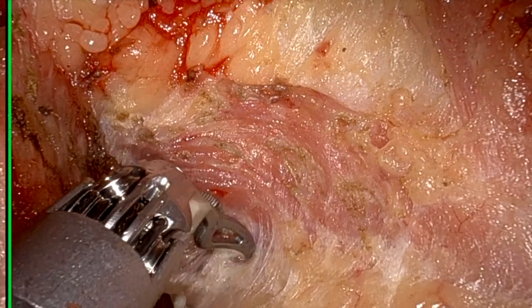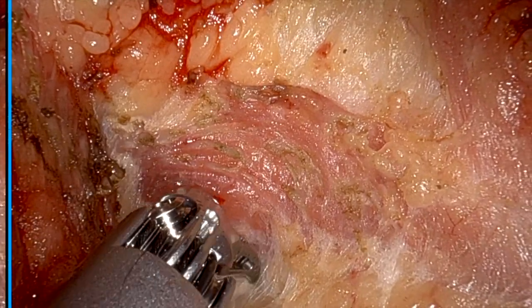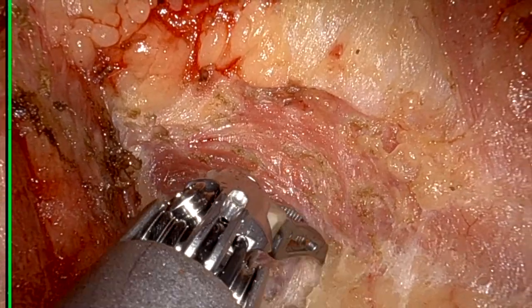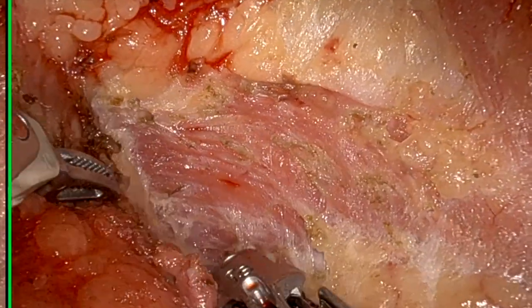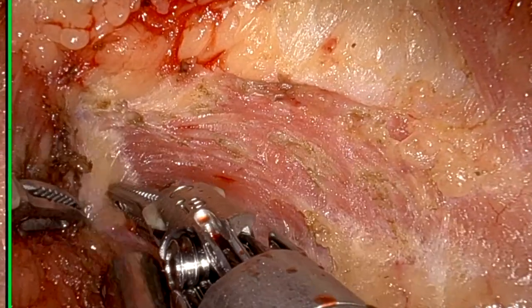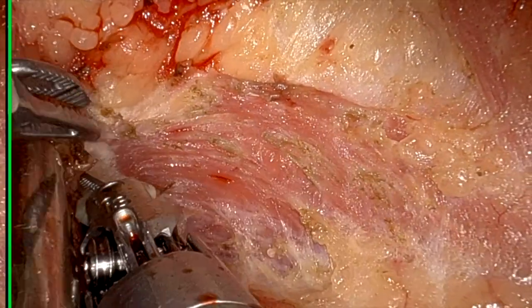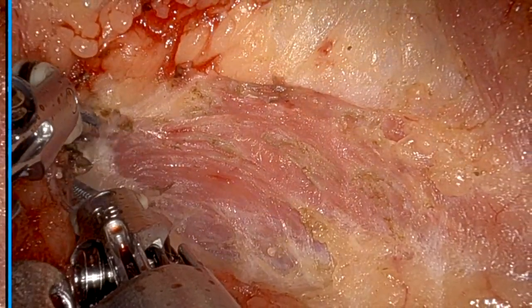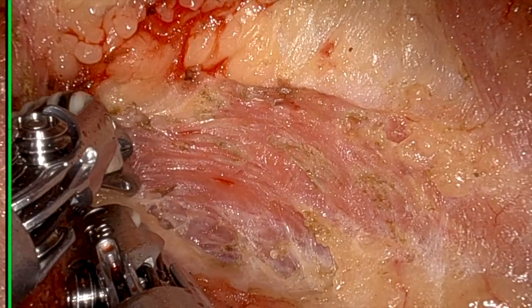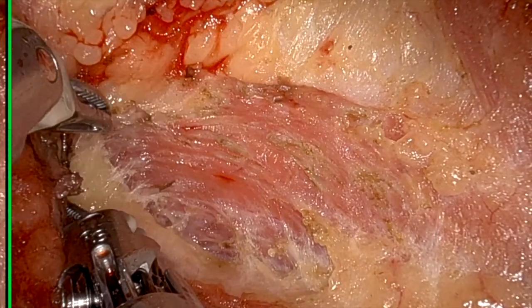Few things about retroauricular approach. This is gasless procedure. We use two instruments or two robotic arms plus camera. I prefer bipolar in both hands. One is Maryland bipolar and other is fenestrated bipolar. So this sharp one from which I am dissecting right now is Maryland bipolar.